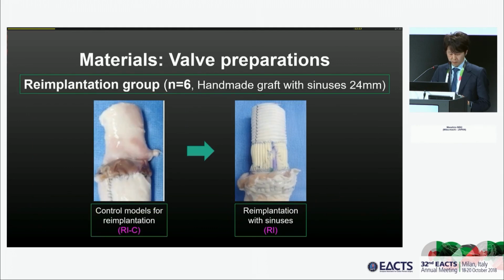Control models were prepared for the reimplantation group as well. Then reimplantation was performed using a handmade graft with sinuses with a diameter of 24 millimeters.